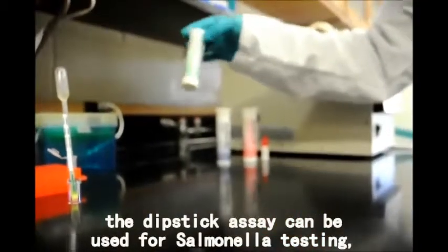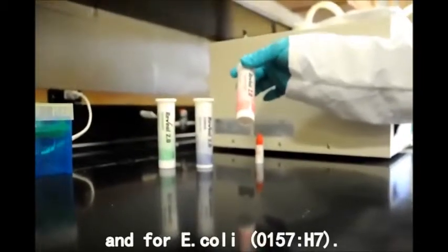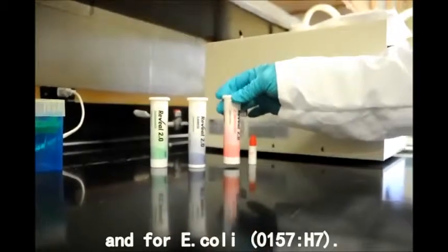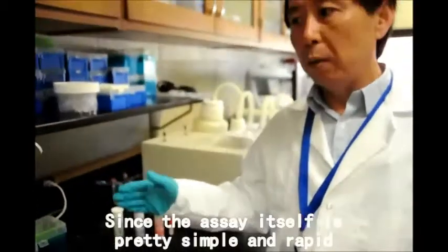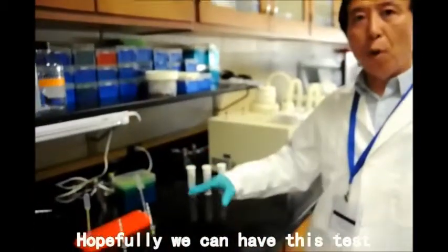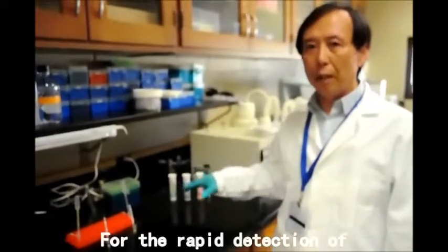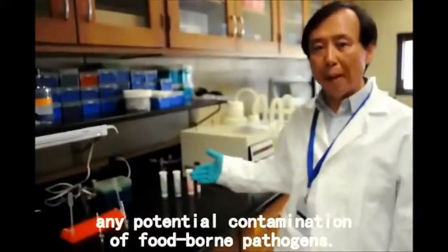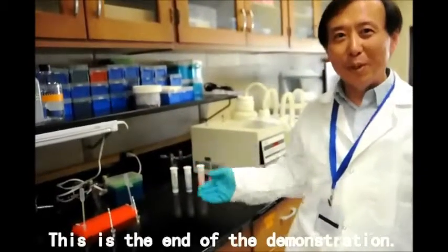In the same format, the dipstick assay can be used for salmonella testing, and also for Listeria and E. coli O157:H7. Since the assay is very simple and rapid, hopefully this test can be performed on the strawberry farm for rapid identification of any potential contamination of foodborne pathogens. This is the end of the demonstration.